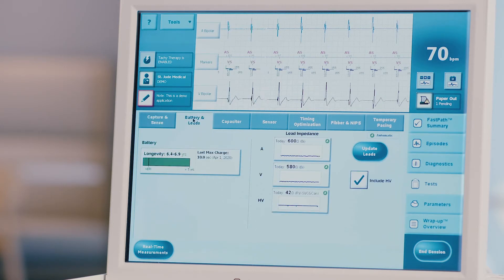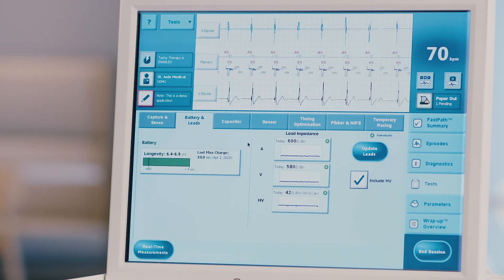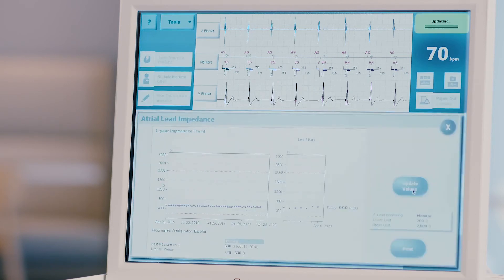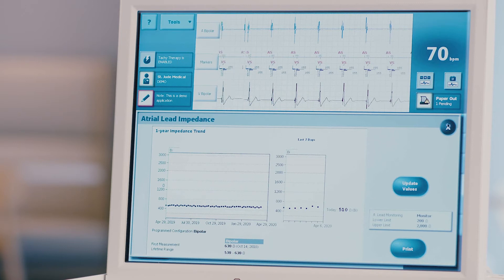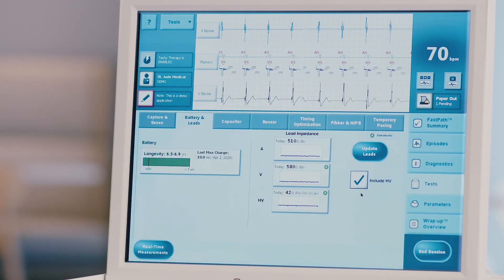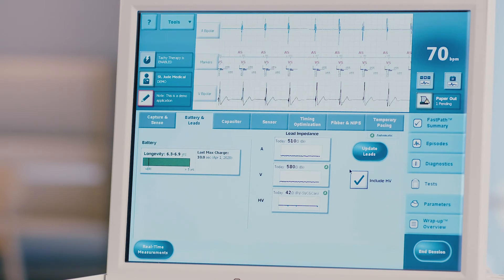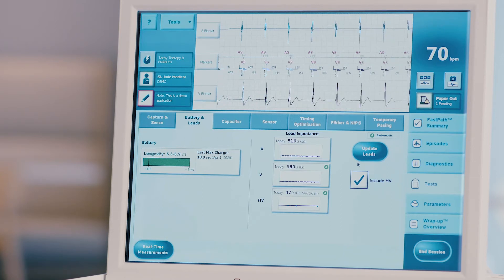Press the battery and leads tab at the top of the screen to perform lead impedance testing if necessary. Choose the desired lead for testing and press the update lead button. This test will run automatically and the measurement will be displayed. Repeat for all necessary leads. Be sure to check the high voltage lead impedance as well. Do not run this test on patients with an ATLAS ICD or EPIC ICD as it will give the patient a 12 joule shock.